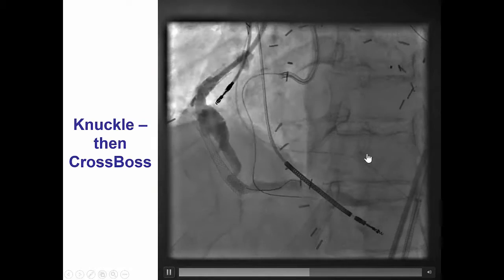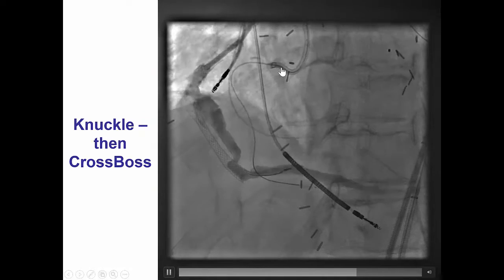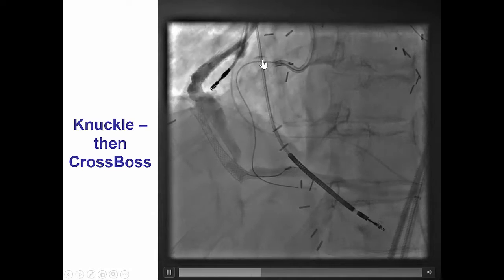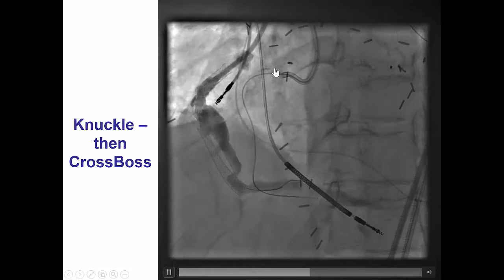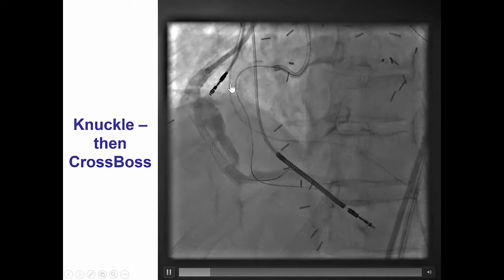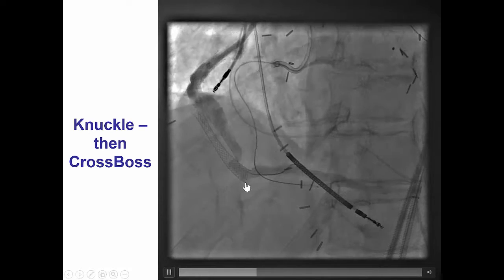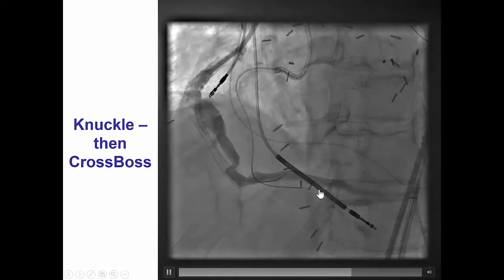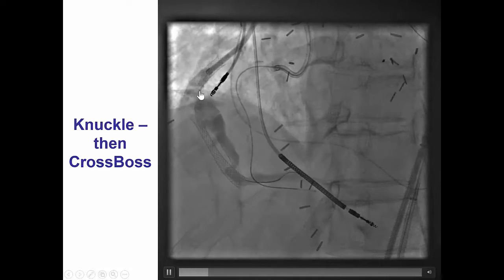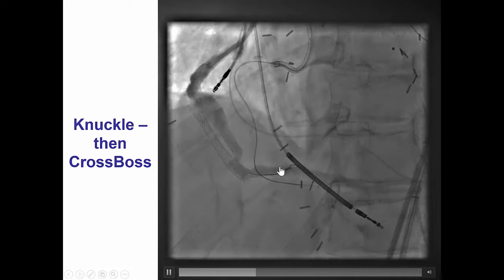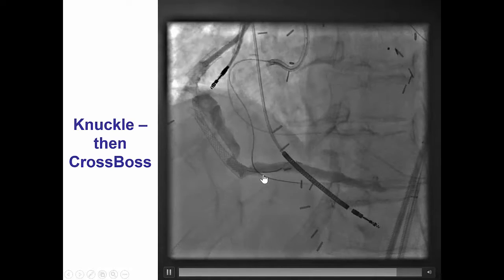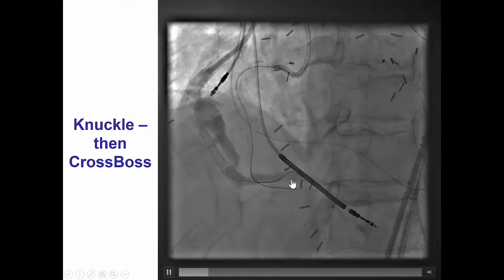In this particular case, we were able to advance a knuckle past the dissection plane proximal to the proximal cap, and then we switched the knuckle wire for the CrossBoss catheter, which was advanced into the vessel. However, the injection from the saphenous vein graft suggests that the CrossBoss is not in the correct position.